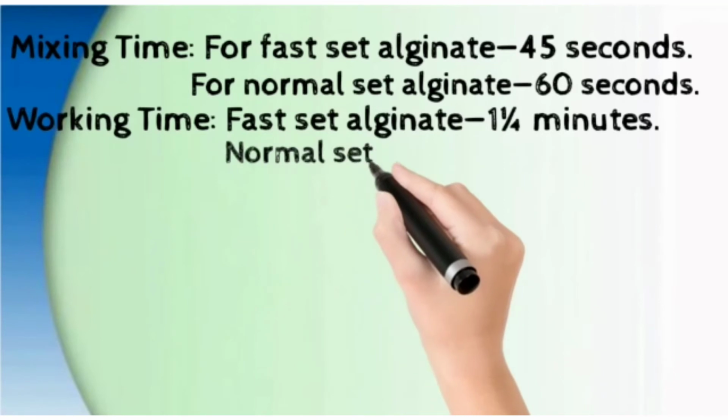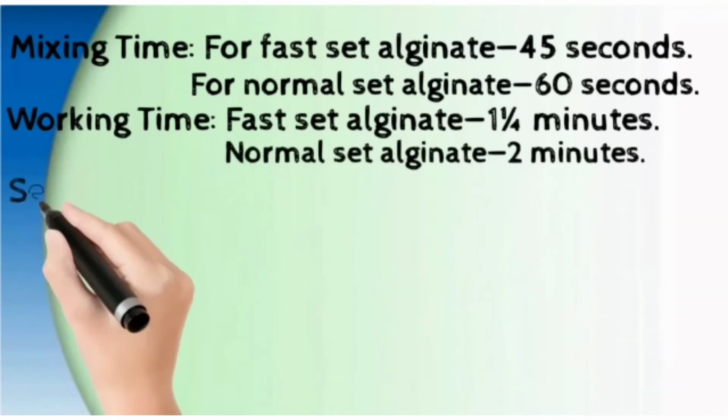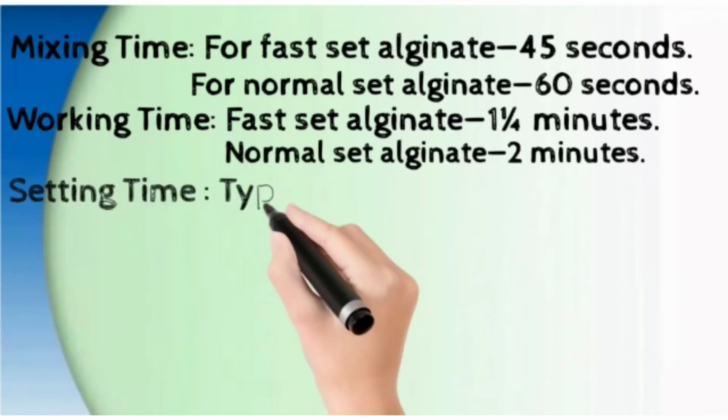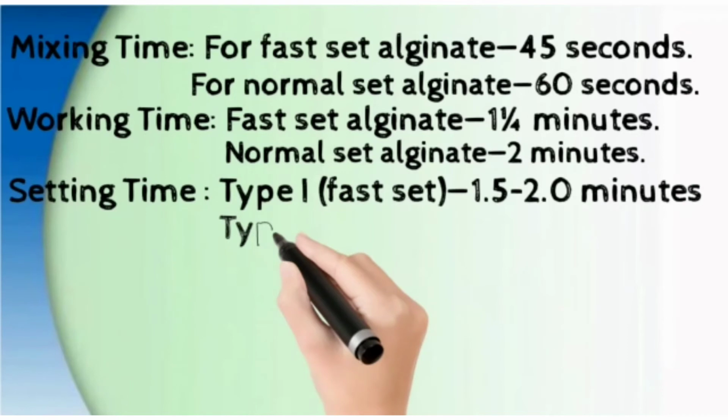Then we have setting time. Setting time for type 1 will be 1.5 to 2 minutes, and type 2 is a normal set, so 3 to 4.5 minutes.